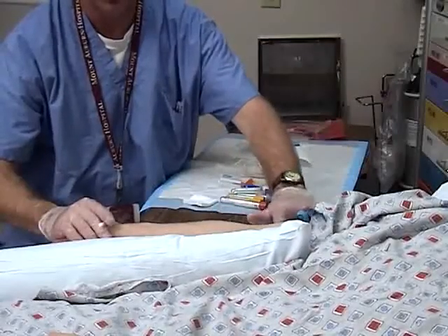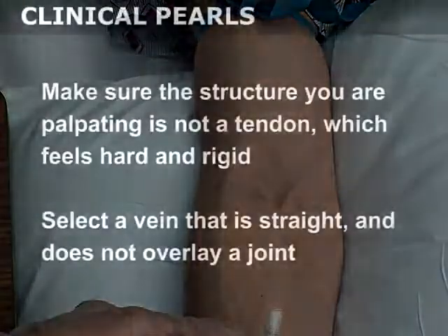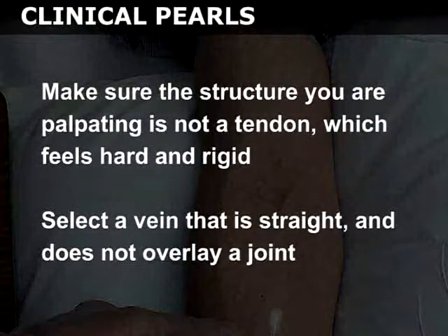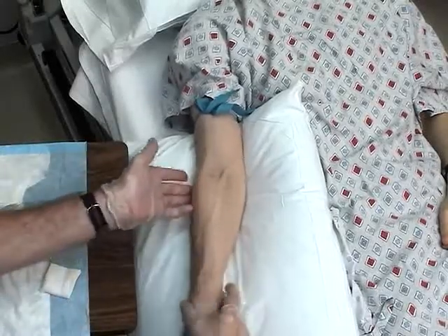Select an appropriate vein for cannulation. Engorged veins are soft and feel spongy. Make sure that the structure you are palpating is not a tendon, which feels hard and rigid. If possible, select a vein that is straight and does not overlie a joint. In this demonstration, the cephalic vein, proximal to the elbow, was chosen.